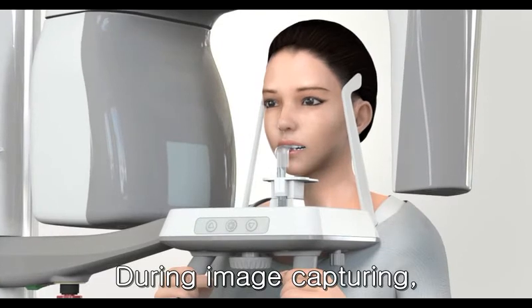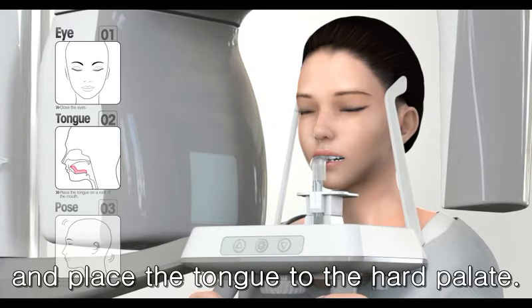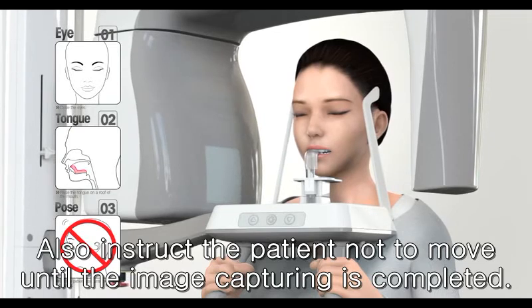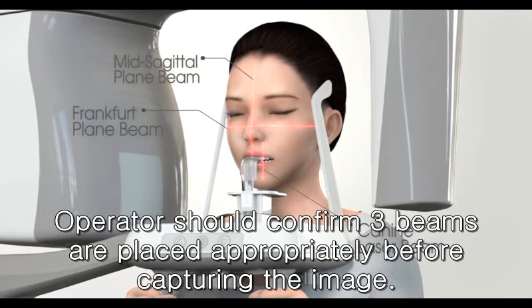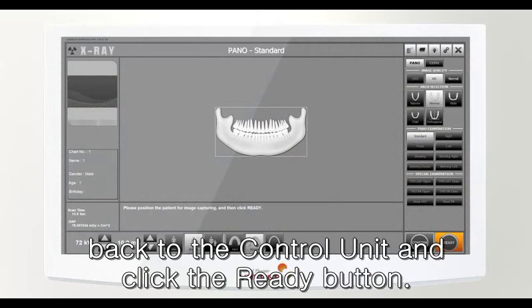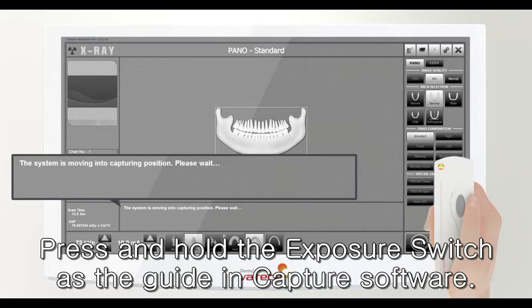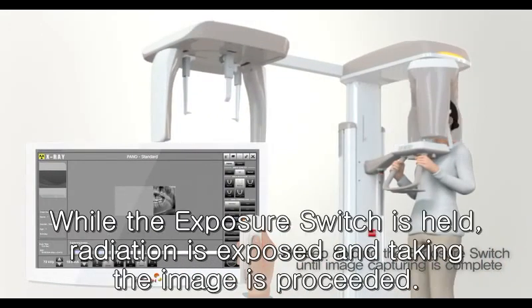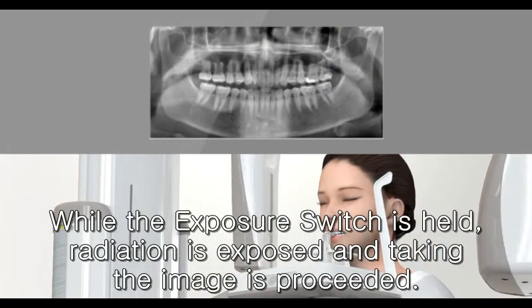During image capturing, ask the patient to close the eyes and place the tongue to the hard palate. Also, instruct the patient not to move until the image capturing is completed. Operator should confirm 3 beams are placed appropriately before capturing the image. Back to the control unit and click the Ready button. Press and hold the exposure switch as the guide in capture software. While the exposure switch is held, radiation is exposed and proceeds taking the images.